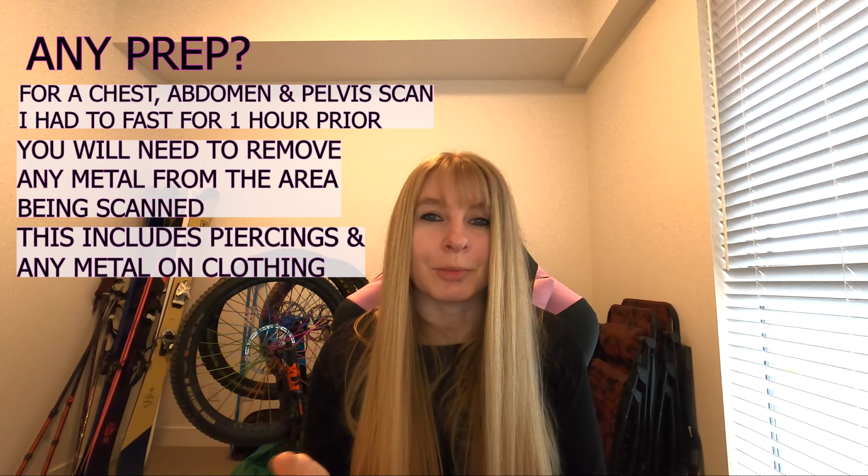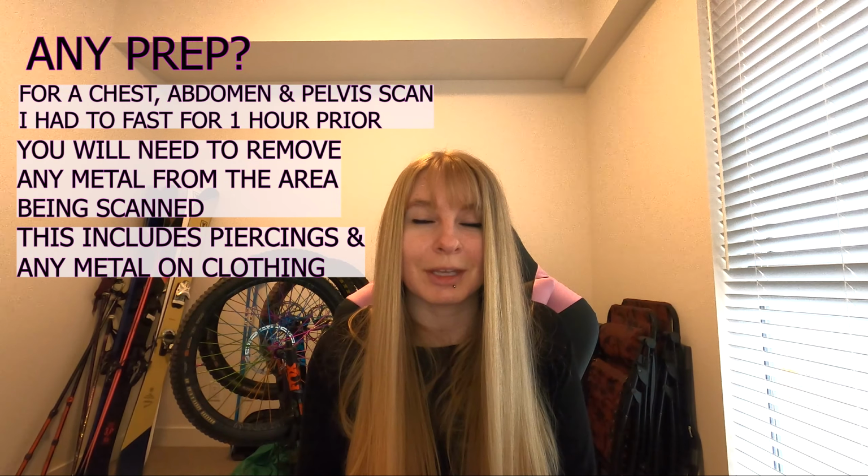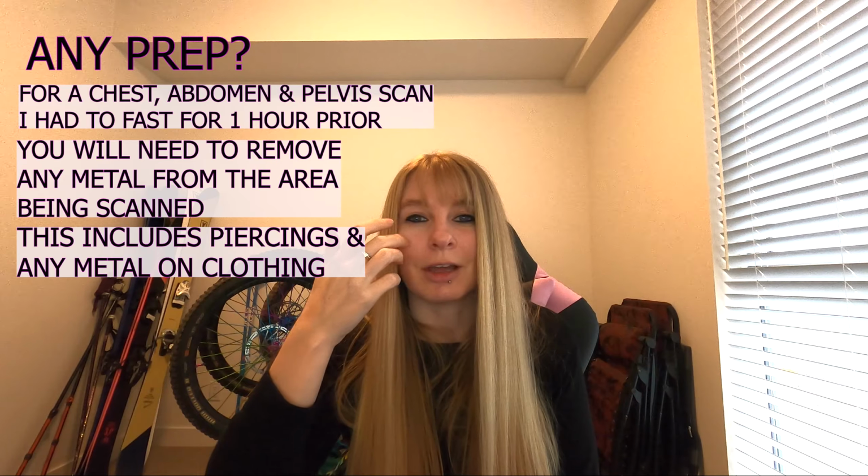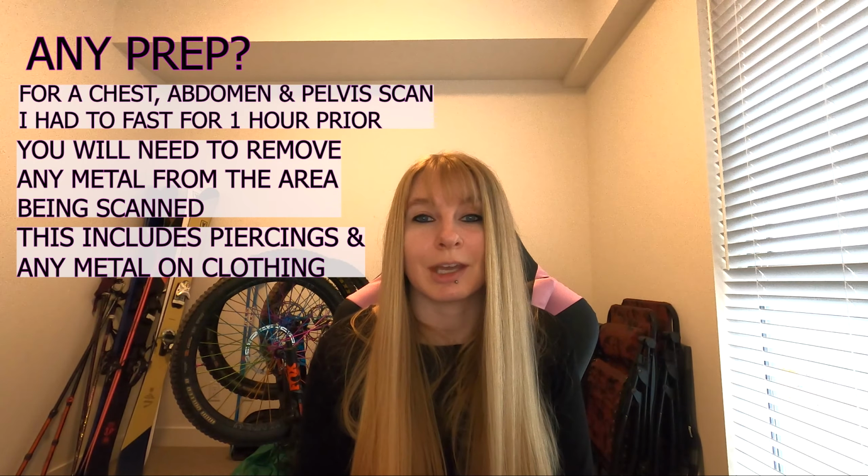I'd actually forgotten about the metal part of this before I went to this scan, otherwise I would have just worn joggers or something, because they don't really need to put you into a full medical gown to do this. They can scan you through your clothes. It's just metal they don't want to get in the way.